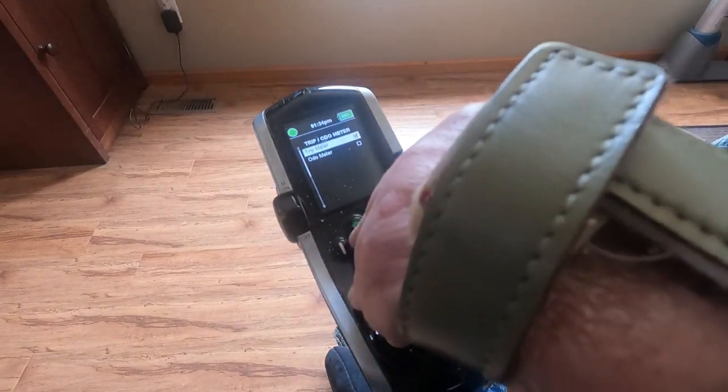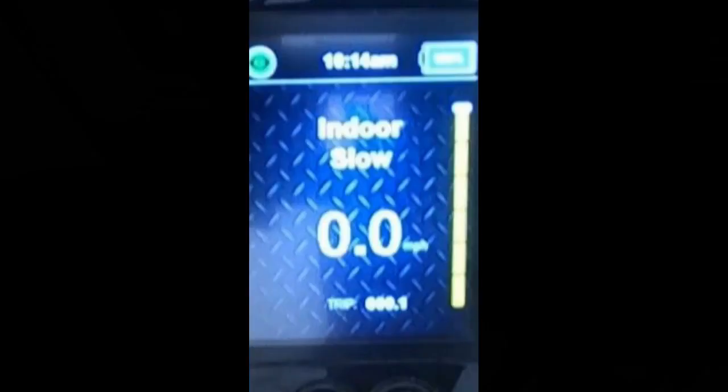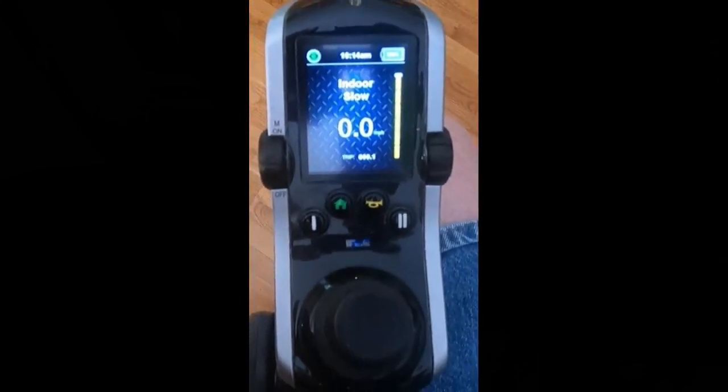When Trip/Odometer is highlighted, again move your handle to the right, then either up or down until your choice of either the trip meter or the odometer is selected. Now when you return to the drive function by hitting the first button, your selection of either the trip meter or odometer will be shown at the bottom of the screen.